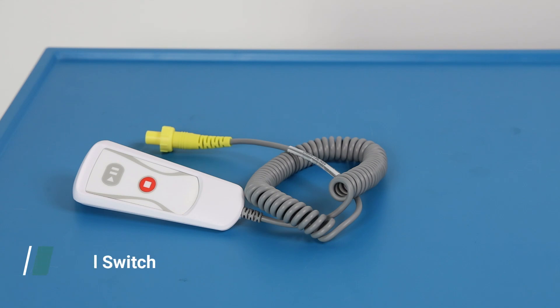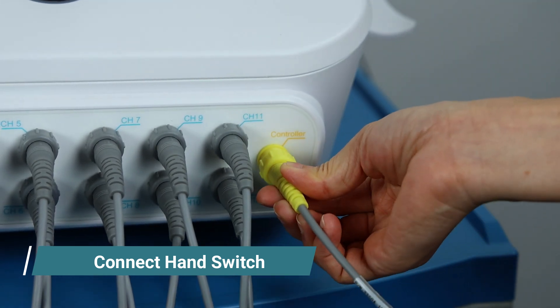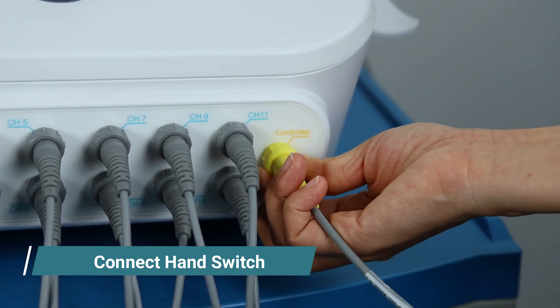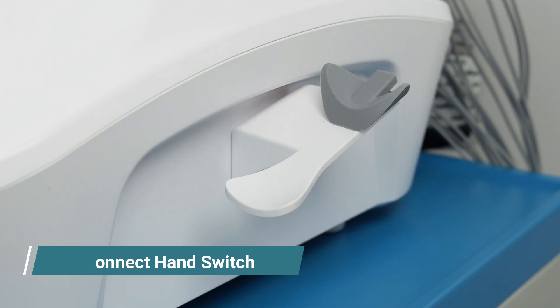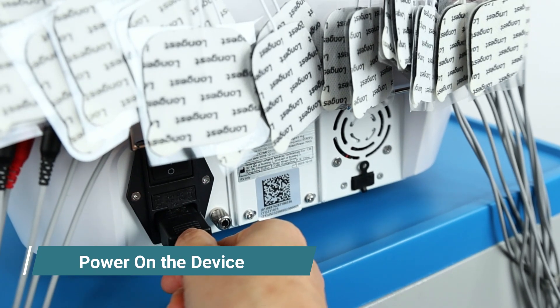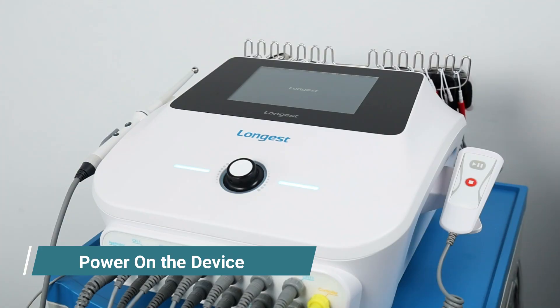Next, connect the hand switch. Follow the arrow mark and insert into the socket, then tighten the screw. Then connect the power cord and press the power button to turn on the machine. You will see the screen light up.